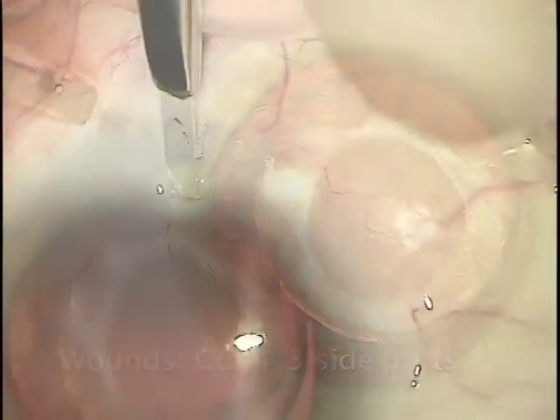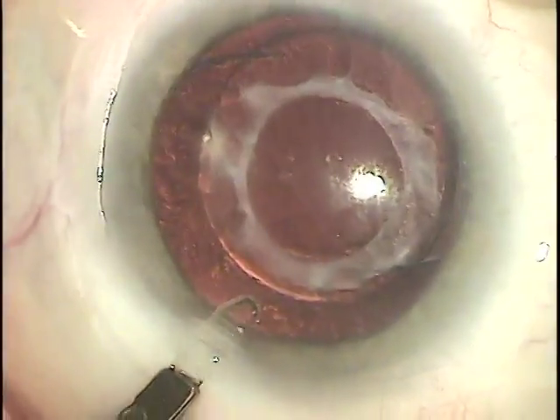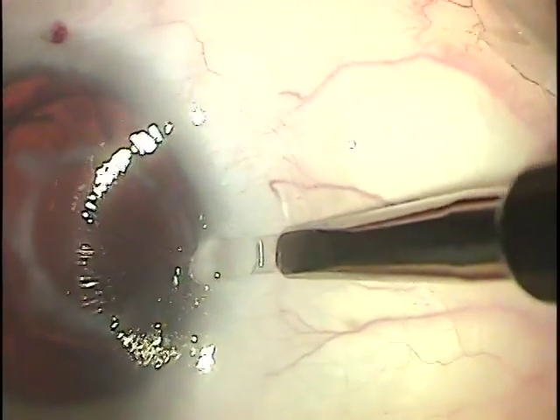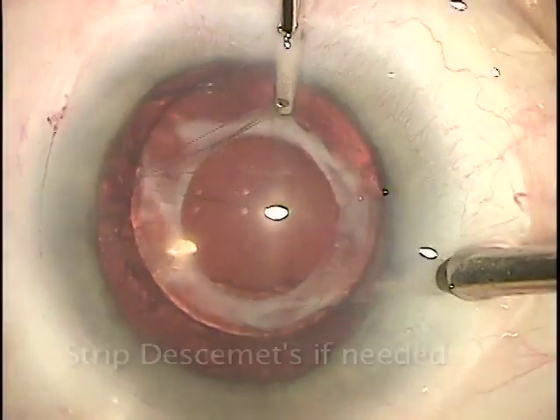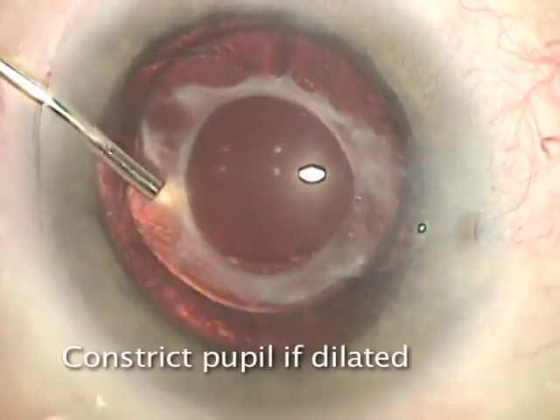We'll make our wounds with one clear cornea incision and three side port incisions for easy access everywhere. We'll strip Descemet's membrane, if needed, from the patient, and then constrict the pupil if it was dilated.